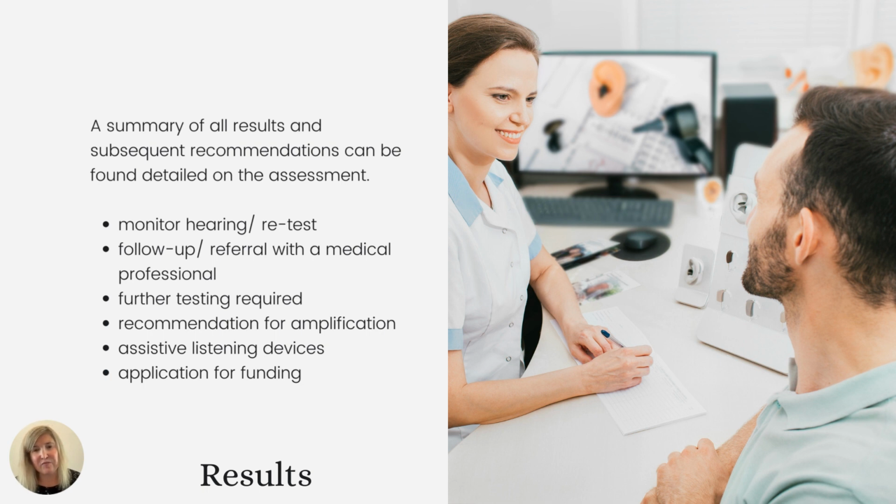The examiner could recommend a trial with amplification. This could refer to hearing aids, cochlear implants, or assistive listening devices, such as an FM system or an ear-level amplifier, and/or looking into applying for funding or different programs.